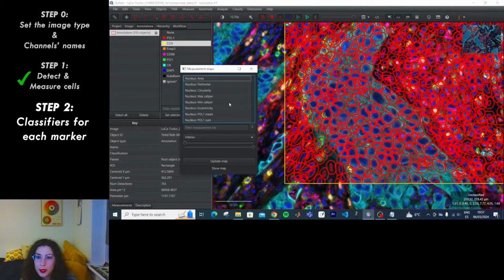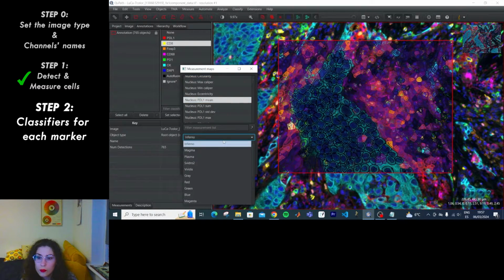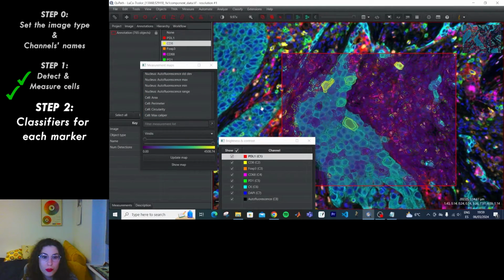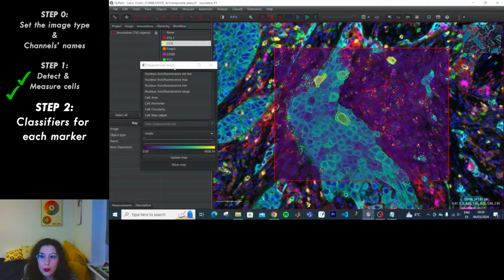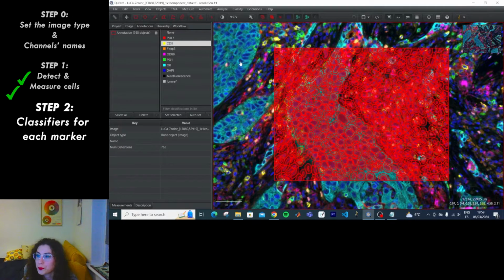Okay, this is where we can see the differences in the channels. Well, okay, I don't know what any of this means. So, if you do, you can find it here and use it. But I am going to just go through to the next step. I know where to find it if I ever need it, but right now, I don't need it. Okay, what's the next step?